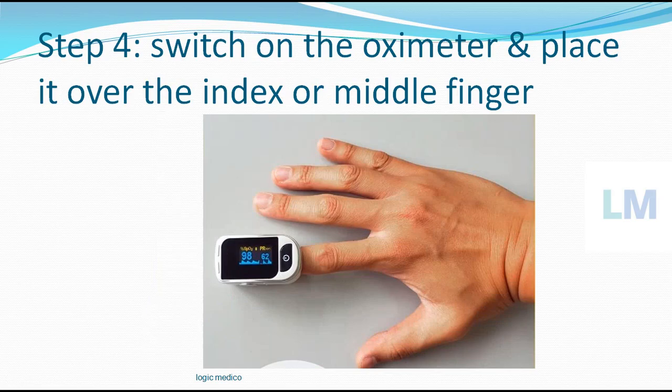Step number 4 is switching on the oximeter and placing it over the middle finger or the index finger. These two fingers are important — it is shown that they are more in line with the blood vessels, so the saturation reading from the middle finger and index finger is higher compared to the other fingers in the terminal position. Kindly use only these two fingers. Switch on the oximeter and place it over the finger — it is like a clip; you can open it and place your finger inside.